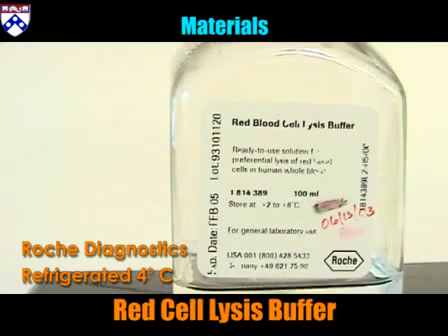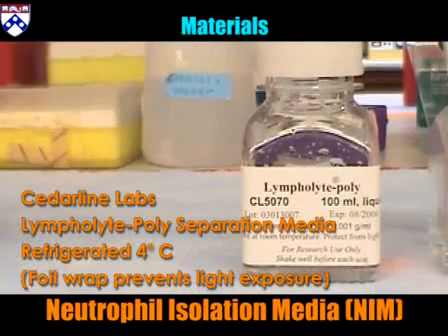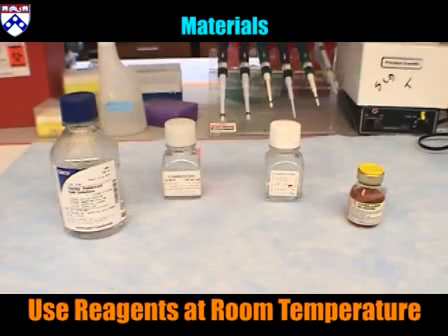Red cell lysis buffer, manufactured by Roche Diagnostics. Neutrophil Isolation Media, NIM — Cedarline Labs Lympholyte Poly Separation Media, protected from light and kept in refrigerator. For best results, all reagents should be at room temperature at time of use. Remove reagents from refrigerator one hour before experiment.